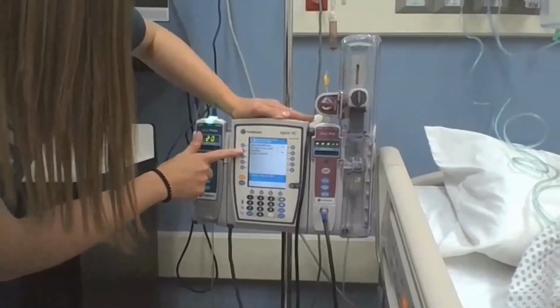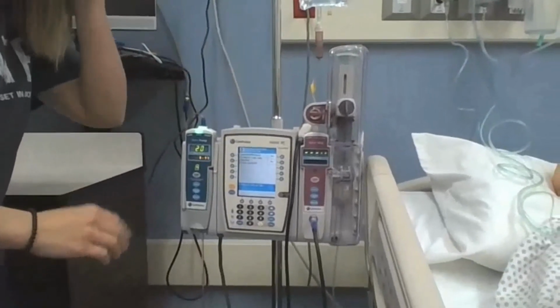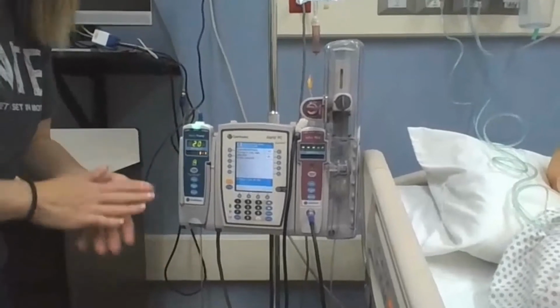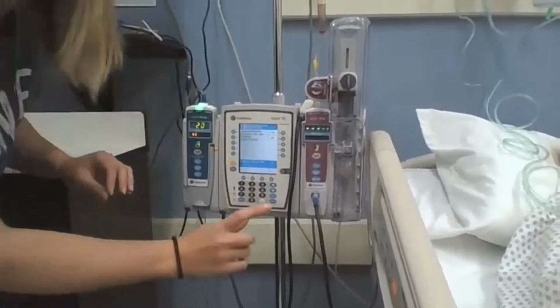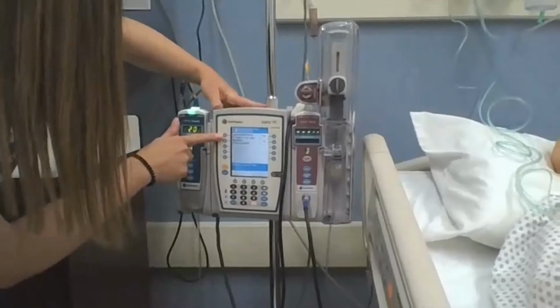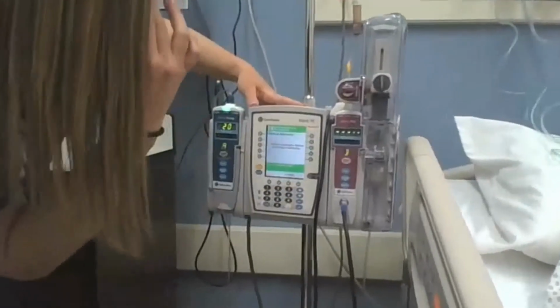It's for acute pain. Now the concentration at the college on these pumps is programmed a little bit differently. This is not the normal standard concentration that you would expect to see at the hospital. So know that this is just for training purposes, but verify your concentration at the hospital with your orders and with the medication that you receive from pharmacy. So in this circumstance for training, it says it's a 0.2 milligrams in 1 ml. Is that correct? And I'm going to hit yes.